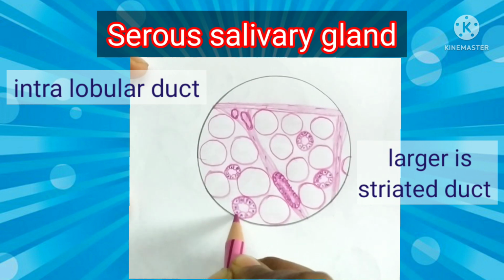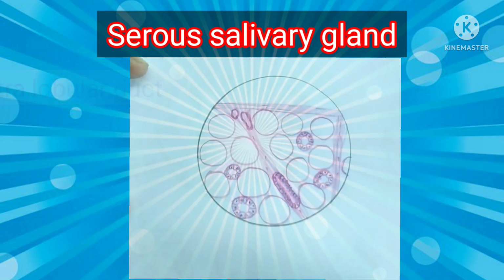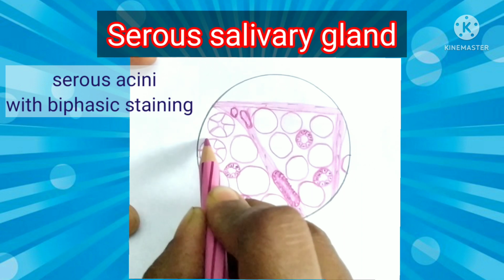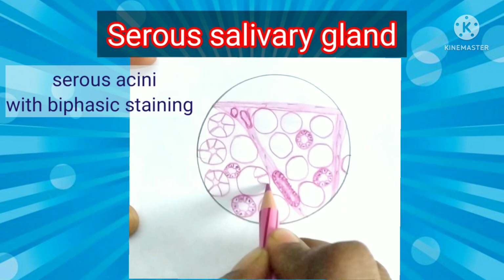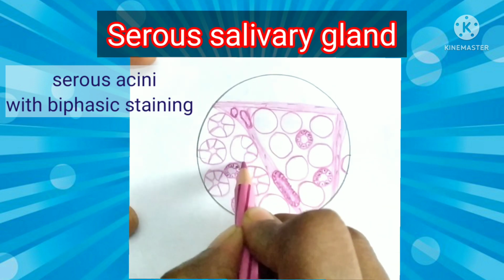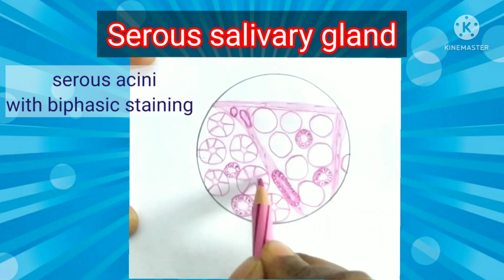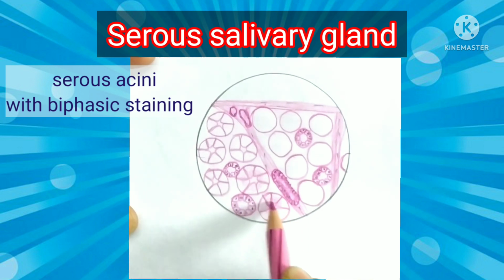You have to show striations with an eosinophilic pencil, as this folding of the membrane is eosinophilic. The striated duct epithelium can be cuboidal to columnar depending on the size of the duct. So make sure you draw the intercalated duct very small with cuboidal epithelium, and the striated duct. These two constitute the intralobular duct.